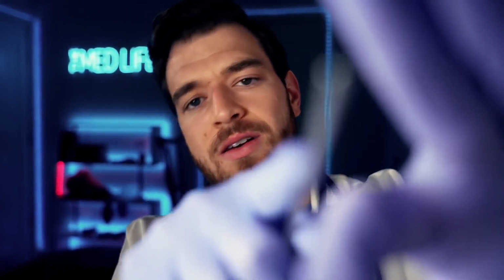This device is known as a tonopen. We'll be using the tonopen to take the pressure. So I'll have you just look straight ahead at me and try to relax. I'm going to hold your eye open here. Good. And you'll just see me tapping the device here. It may feel strange. It's just lightly tapping against your eye. Good. Good. And I'll check the pressure here. There's my reading, 12. Very good.